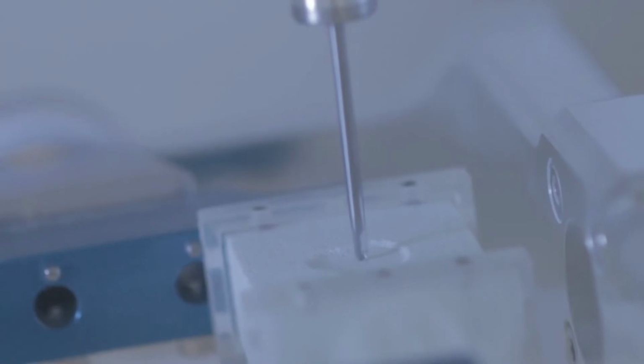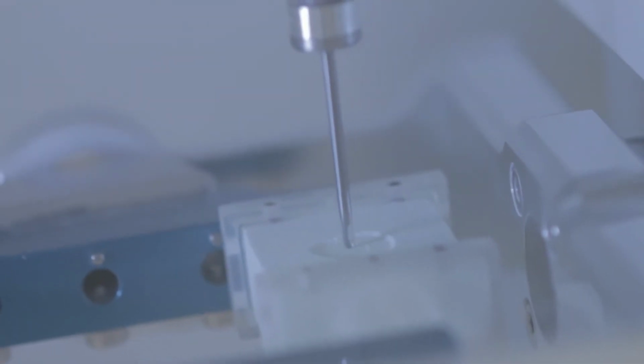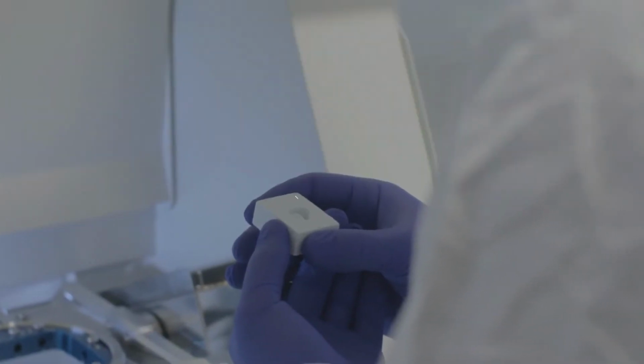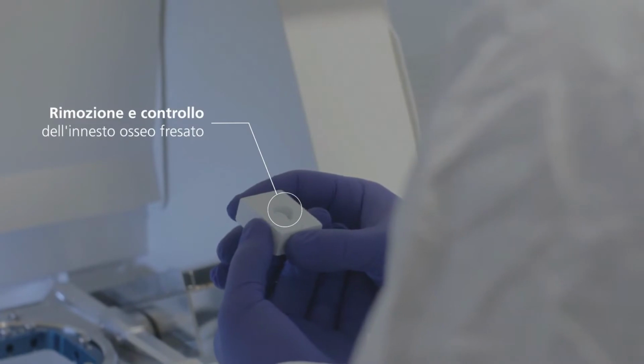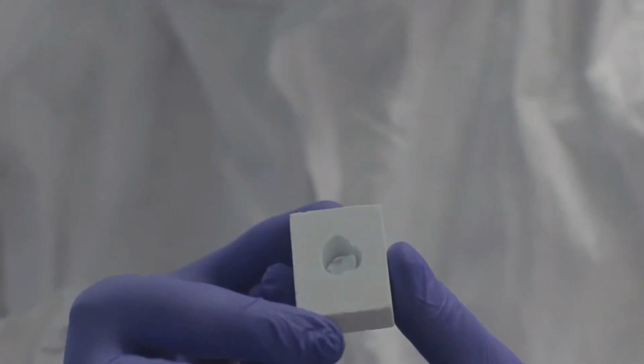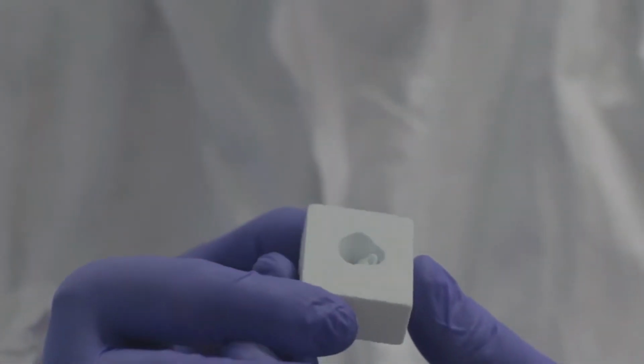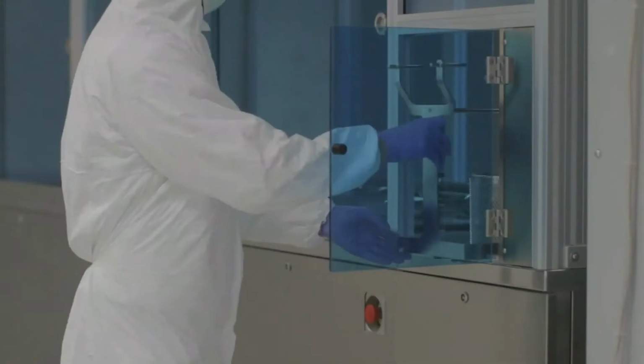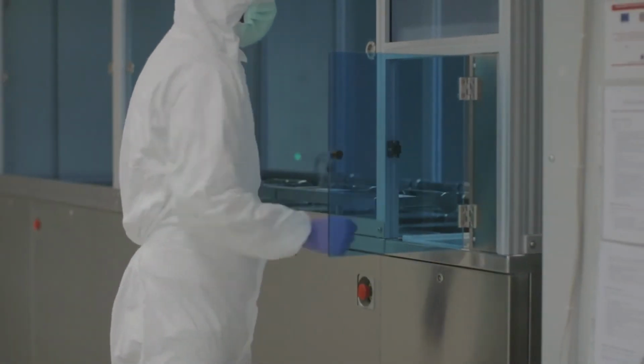The material used in this case is a hydroxyapatite and beta-tricalcium phosphate combined together. We can have different combinations: 70-30, 70% beta-tricalcium phosphate and 30% hydroxyapatite, or eventually 60-40. In this case, we are talking about a proprietary material developed inside this company that works very well for this specific application.